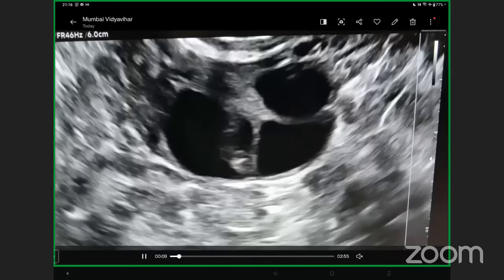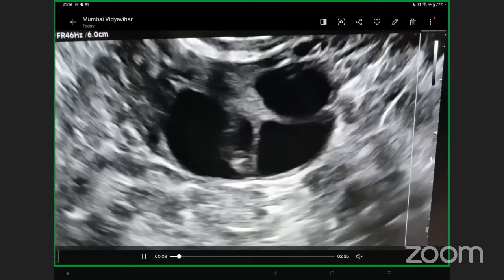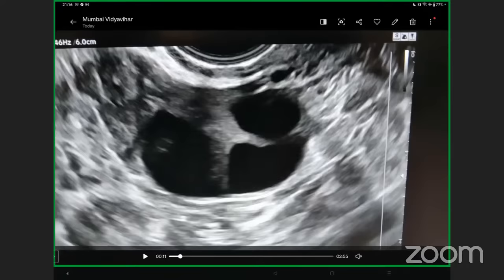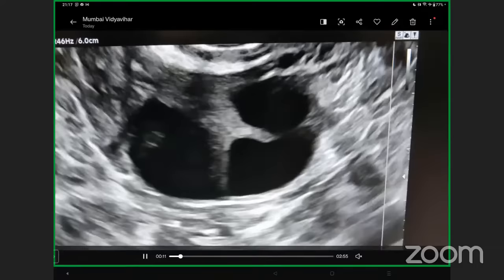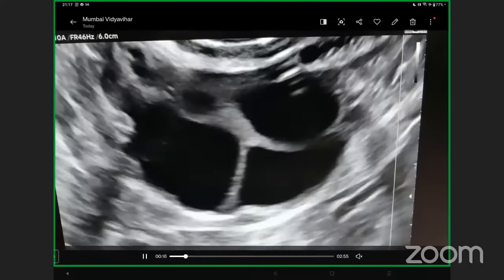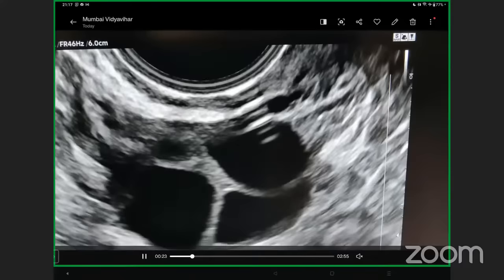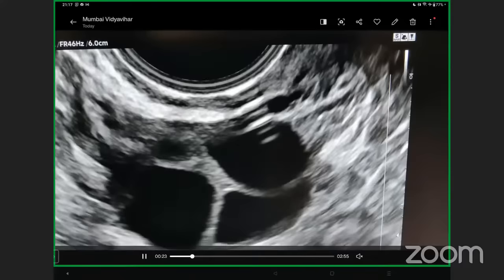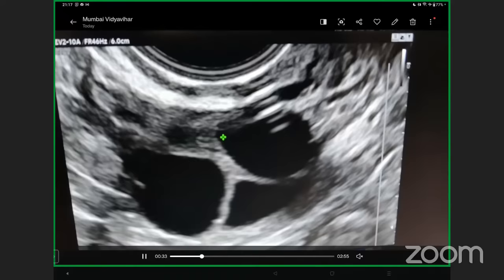This is what our basic ultrasound looks like. Remember the first rule: zoom it in. Always zoom in — never try to do folliculometry without zooming in. A lot of people have remotely accessed follicles and make huge mistakes because they have not zoomed in. There is a scroll button on the right side of your machine to zoom in and out. Always measure your follicles on a zoomed image.